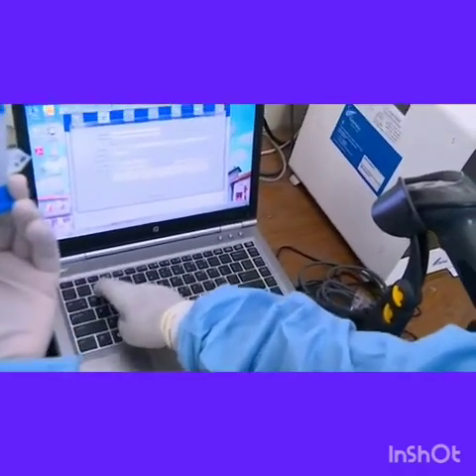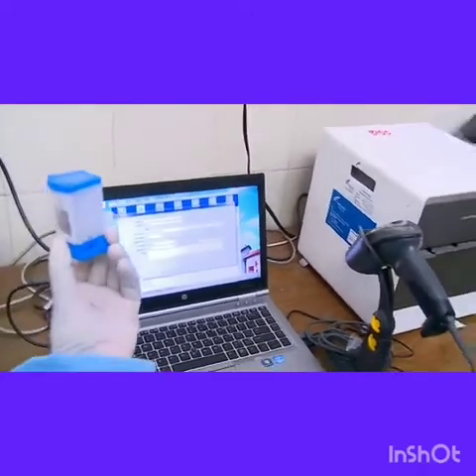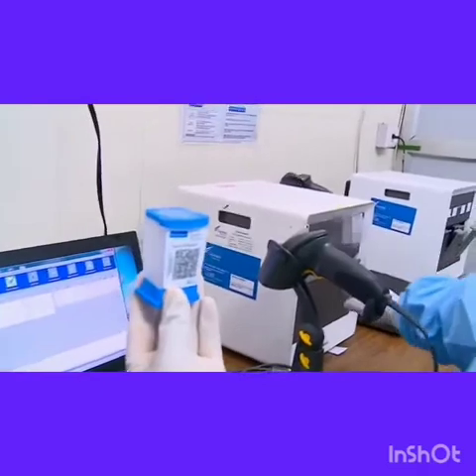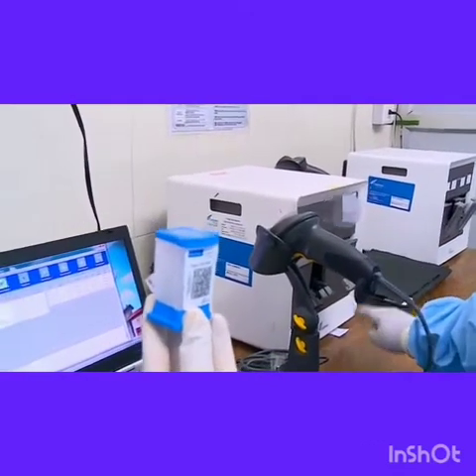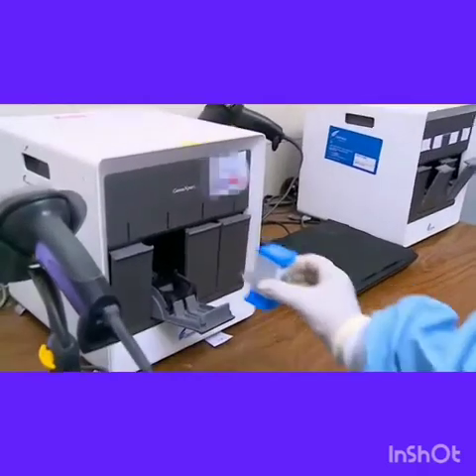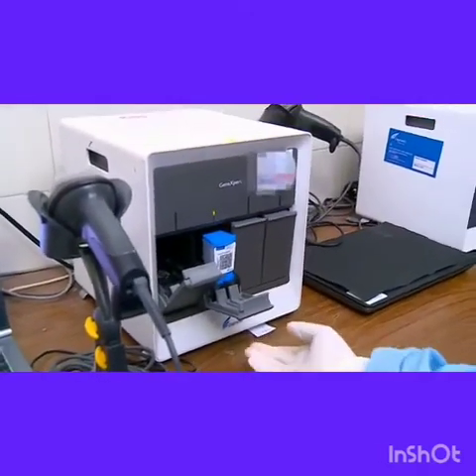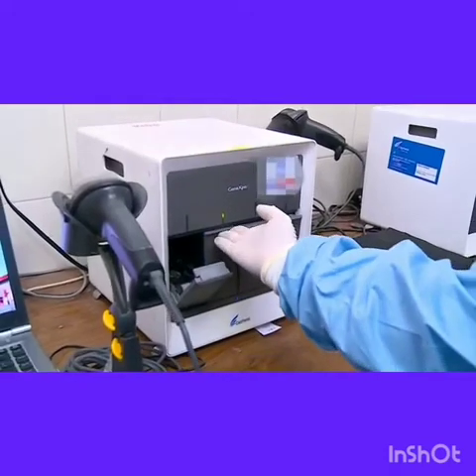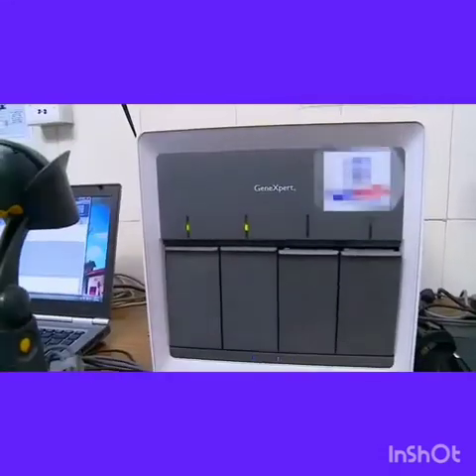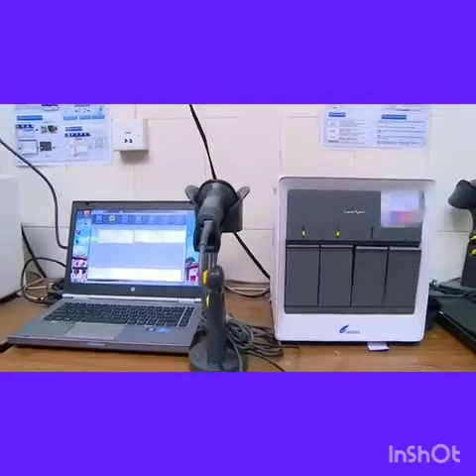The lab ID is entered onto the patient details column, and the cartridge is loaded onto the slot or module indicated by the machine. We can see the green light which is the indicator. Once the cartridge is placed, the module is closed. We have now loaded 2 cartridges and then the run starts.